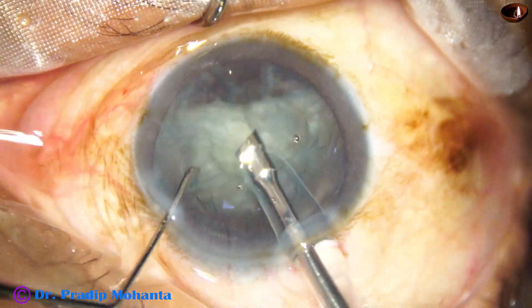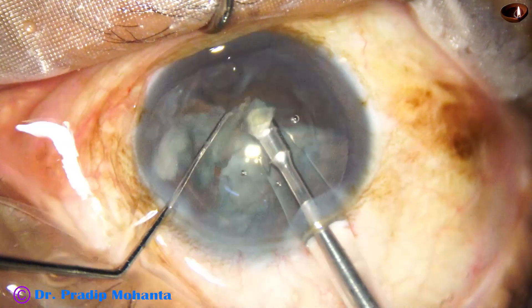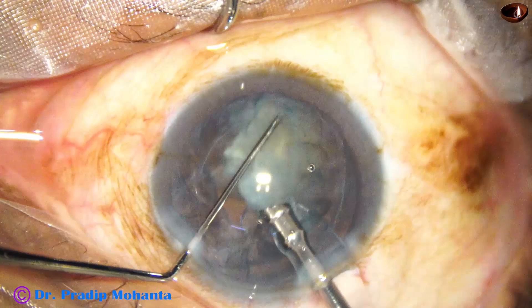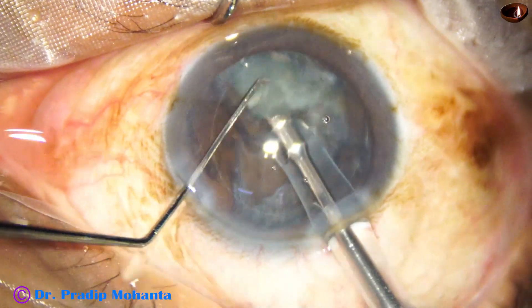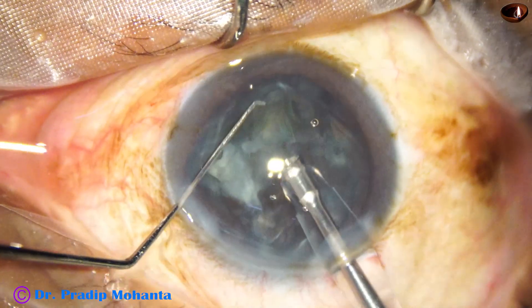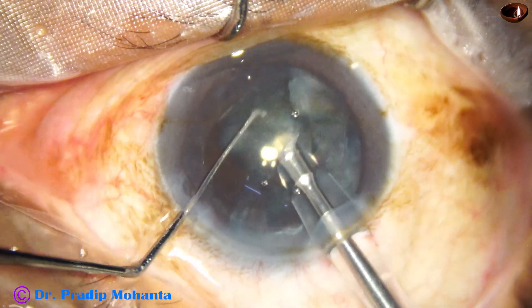Ultrasonic energy used in this case is set at 60%, but the actual ultrasonic energy required is much less. Vacuum is 480 millimeters of mercury and aspiration flow rate is 48 ml per minute.